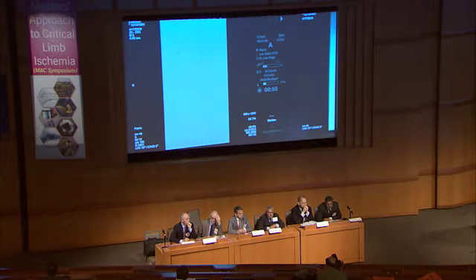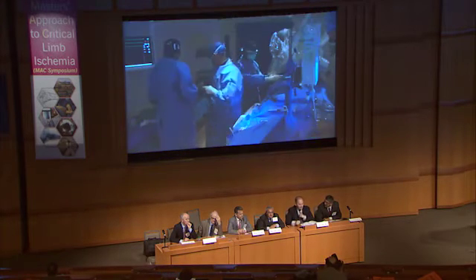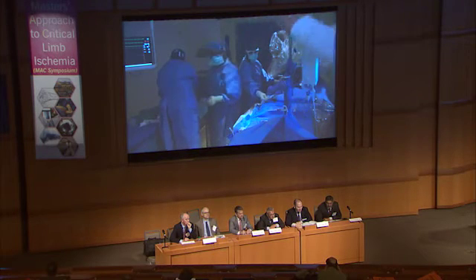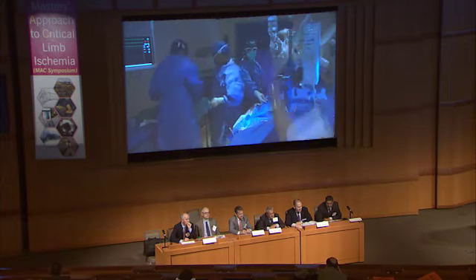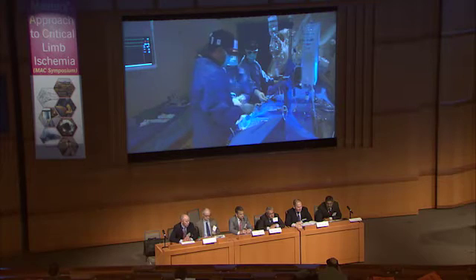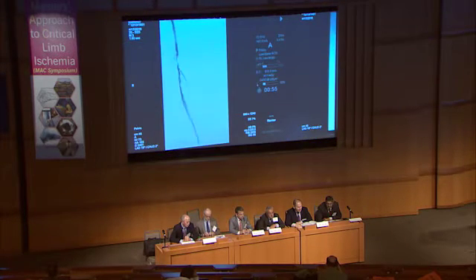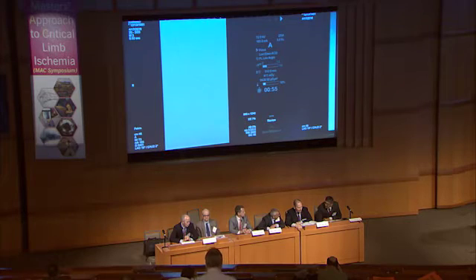So, Alec, can you tell us how would surgery handle this situation? This is a good question. I guess my question is, if we don't deal with the AV fistula, you would be offering this patient a common femoral to below the knee bypass. Is that correct? No, if I weren't doing this endo, then I would do a femoral to distal AT bypass. And this way you wouldn't have to deal with the AVM.